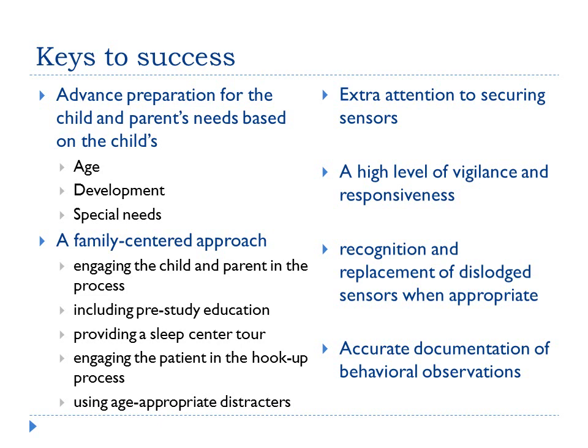As far as running your study, you want to pay extra attention to securing your sensors before lights out. This will save you headache after headache if you do a good job with this. Maintain a high level of vigilance and responsiveness during the study. Recognition and replacement of dislodged sensors when appropriate. And what this is referring to is if the patient just fell asleep and an electrode goes bad and they took a long time to fall asleep, you may choose to just leave that electrode as is until the patient wakes up again. You may not want to disrupt them and waken them when you've struggled to get them asleep.